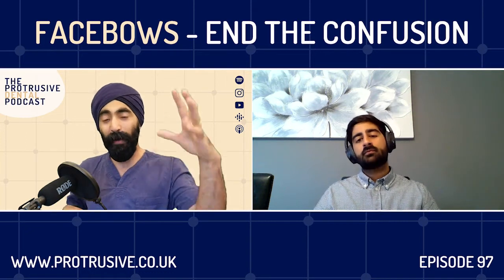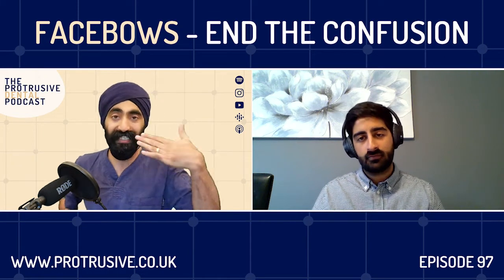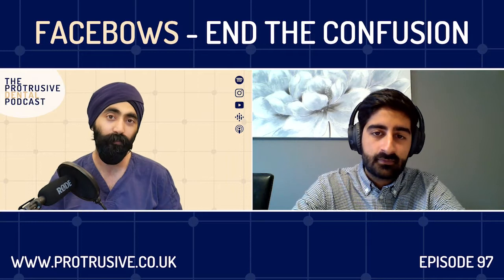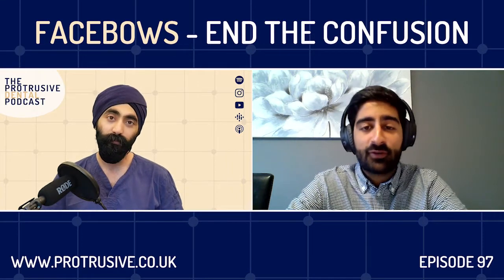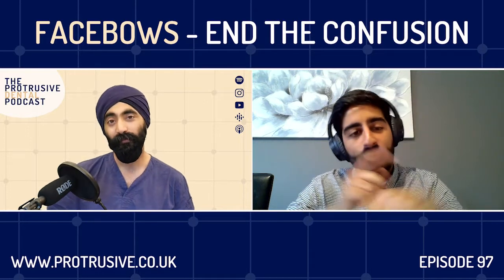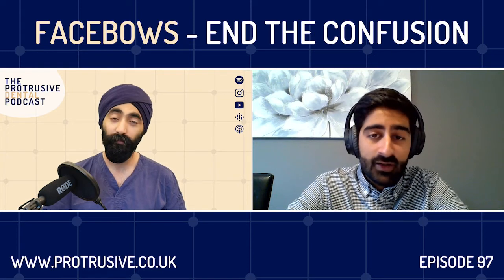So tell us now about this really cool tip you shared about how to overcome this stick bite because it's so flimsy. Please share, because it was really clever what you did. Yeah, so when I started at the Eastman, there were two supervisors who really helped me out and gave me a lot of tips with my cases. Two of them recommended that you roll up some putty, freehand. You can place it over teeth or even an edentulous ridge.